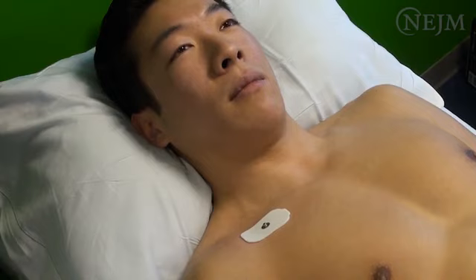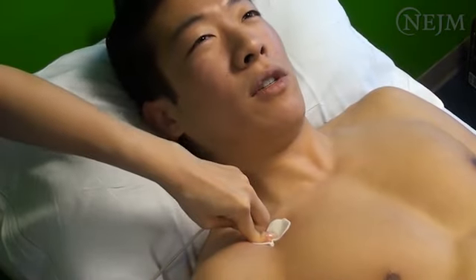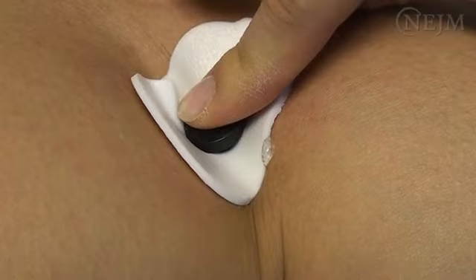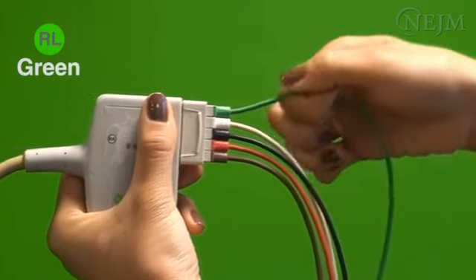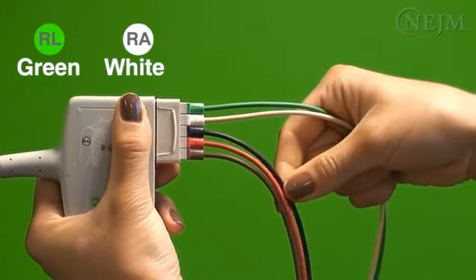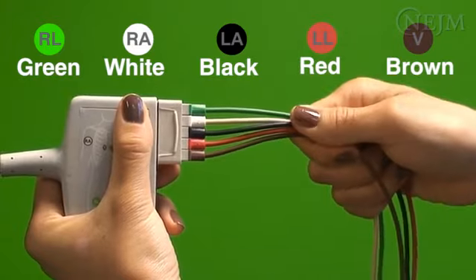Attaching snap-on lead wires to electrodes after the electrodes have been placed on the skin may require you to apply undue force, which may cause patient discomfort and may cause the conducting gel to spread, making the gel ineffective. Lead wires are standardized according to color, although the color coding is not uniform worldwide. The lead wires shown in this video conform to the color conventions recommended by the American Heart Association.